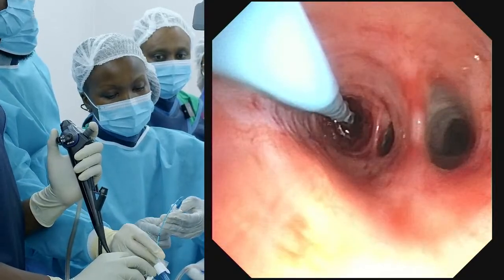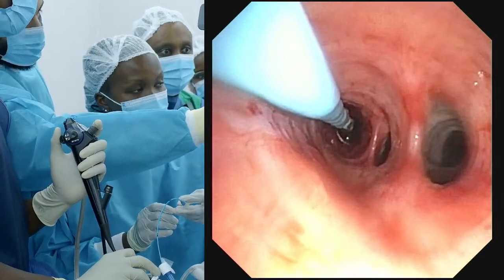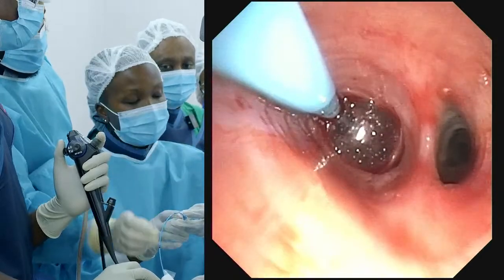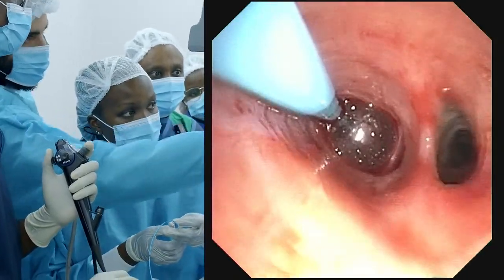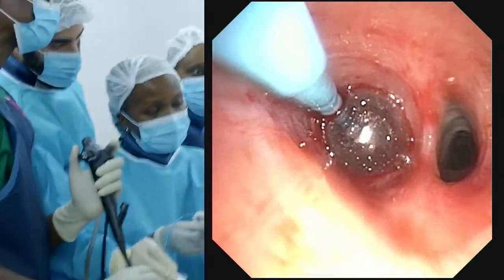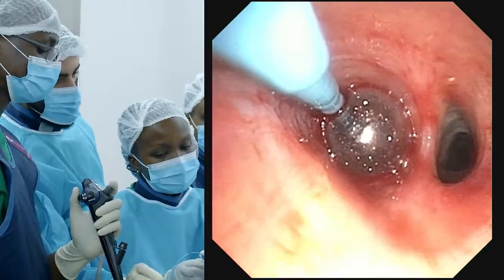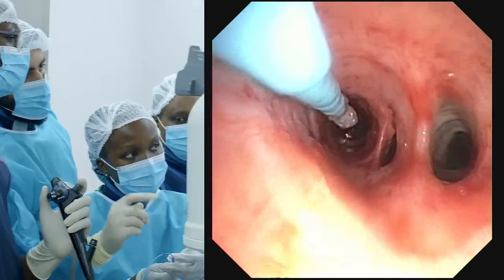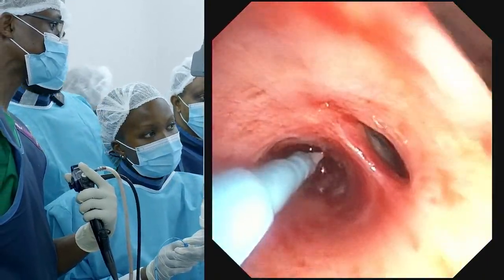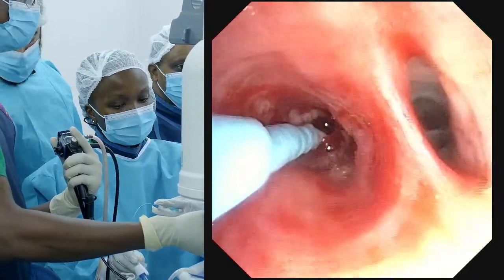Now you can see the tip of your balloon. So you know which bronchus you're going to occlude. You can inflate it again, just check. Good. Now you see, it's a little deeper. If you want to occlude this one as well, you'll do it like that. So I'll go lateral. It's really a team effort. So now, Andrew, you can pick the segments based on what you include. I'll go here. Good. So when you're ready, ask for the probe.